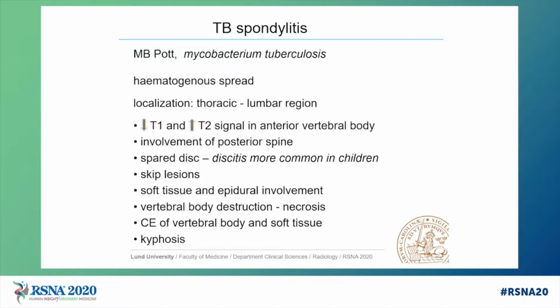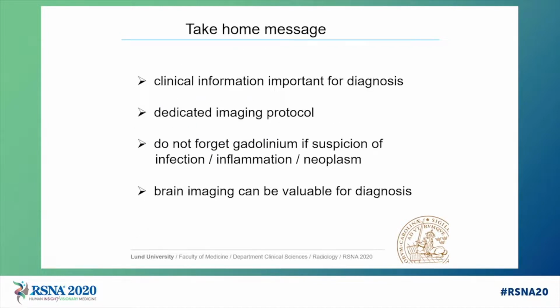So my take-home message is clinical information is important for the diagnosis. Use dedicated imaging protocol. Do not forget to use gadolinium if you have a suspicion of infection, inflammation, or neoplasm. And brain imaging might be a valuable addition for the final diagnosis.